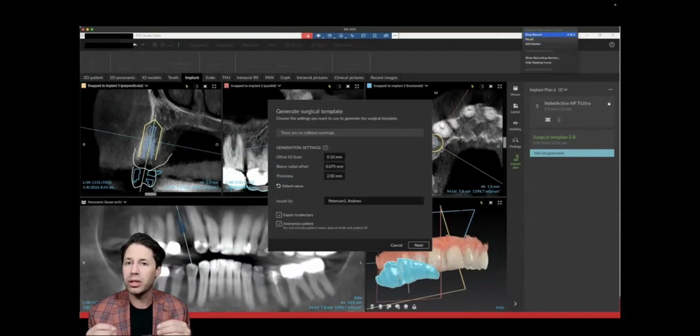So not only are we able to 3D print guides to make our implants safe, predictable, and much more quickly than in the past, I'm also able to 3D print temporary crowns. So no more going around with that missing tooth for 4 to 5 months while the implant heals. As long as the implant goes in nice and stable, I am able to insert a 3D printed temporary crown. I've been working with a lot of my referrals. They almost think that the 3D printed temporary is the final crown.